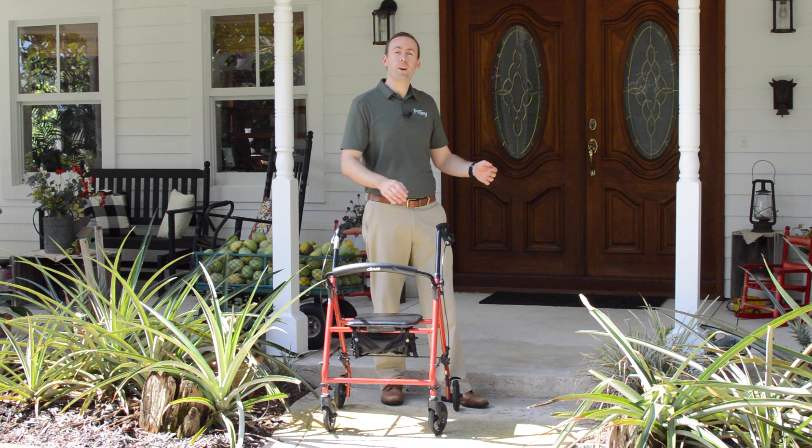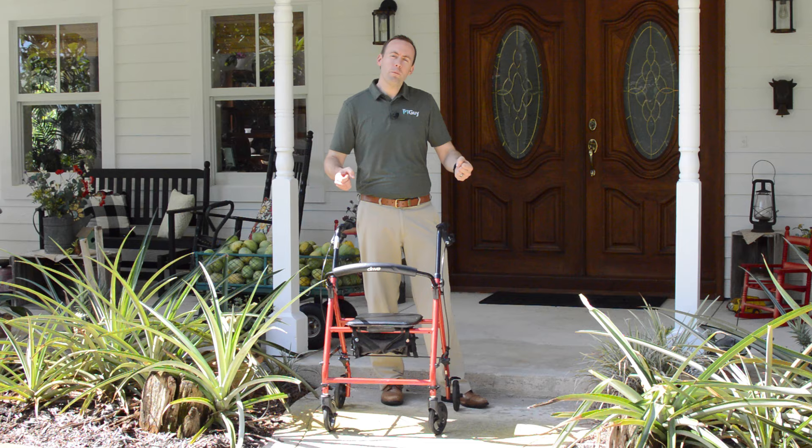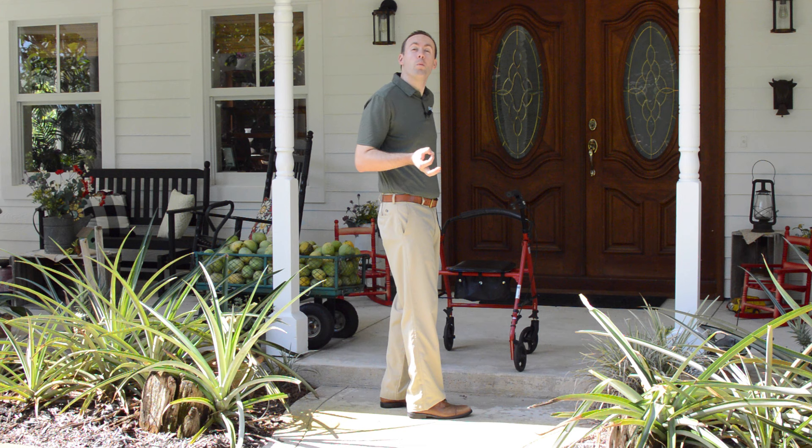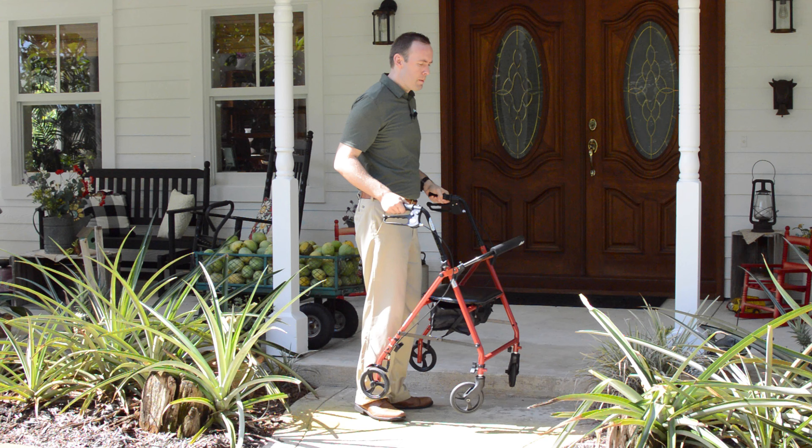So first I'm going to show you how to come up the step and then I'll show you how to come down. The tricky part going up the step is sometimes people try to lift the whole entire walker up onto the step and they end up hurting their back and they also end up throwing their balance off and almost having a fall or having a fall. We don't want to have falls. So what I tell people is one of two ways to go up.